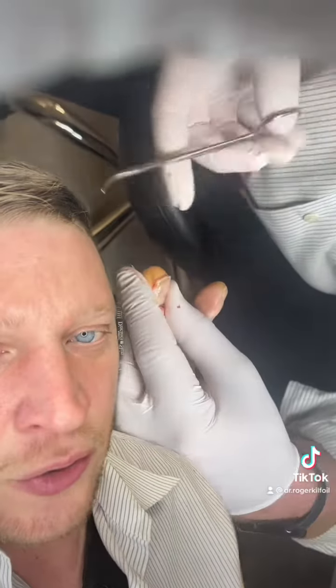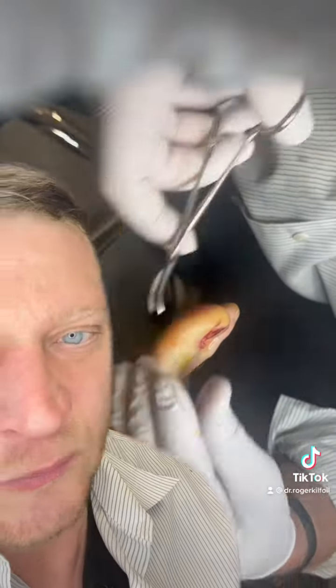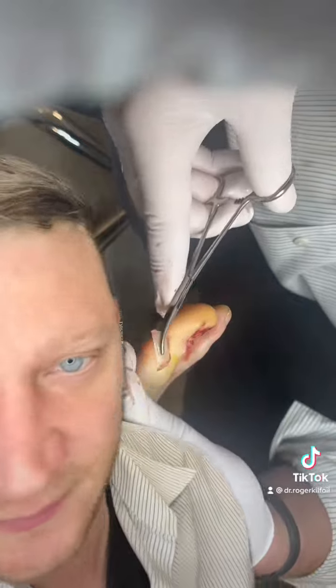Now here is the coup de grâce. Gross. Ew. Crazy.